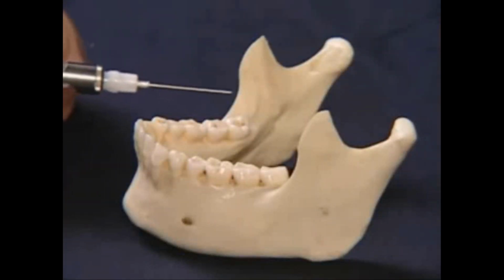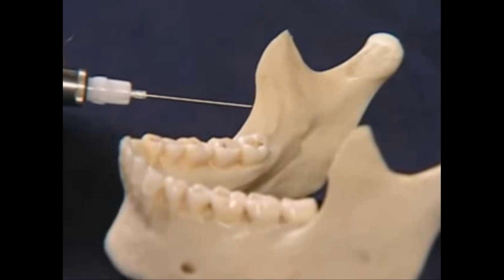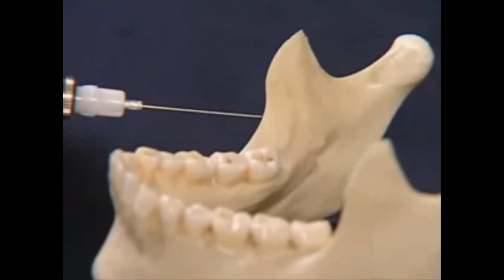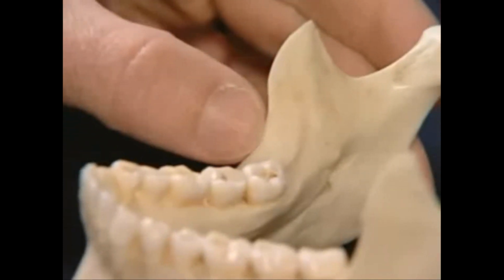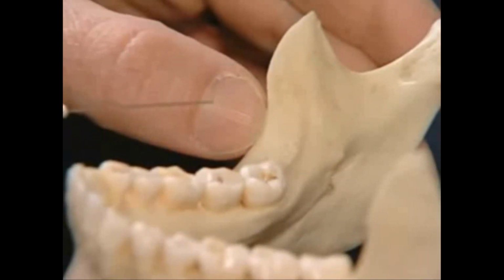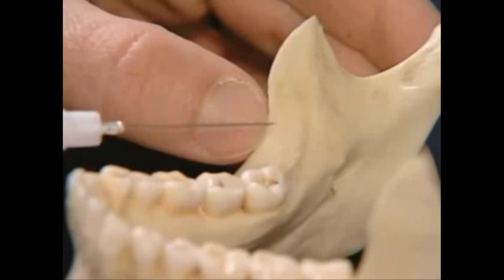You begin by looking at the anterior border of the ramus, which is shown here, and feeling for the greatest depth, which is the coronoid notch of the external oblique ridge. This point should be palpated with your thumb or finger, and the greatest depth noted, because that will correspond to the height of injection, which is usually between the midpoint to height of your fingernail.